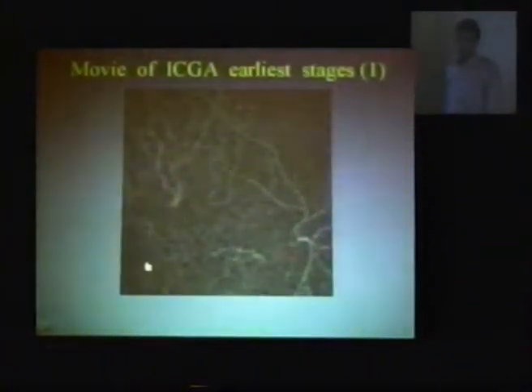How do you localize the vessels to the patient to treat it? I don't understand, I'm sorry. Yes. Here it's very clear. Yes. But with the patient, if I want to shoot the vessel, how do you find it? We get to that. First, there's several stages. First, we have to see the vessel. Okay? Only 1 out of 10 patients can you find the feeder vessel. It's very hard. Okay?